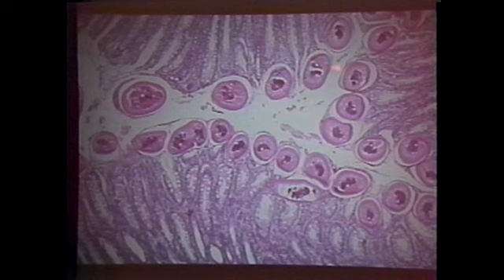Now, the nematodes that I've just shown you are phasmids. I'm about to go through the aphasmids. Now, you're wondering, what is a phasmid? A phasmid is like a little pimple around the anus of the worms. Have I ever seen one? No. Will you ever see one? Probably not. But they break them up into groups.